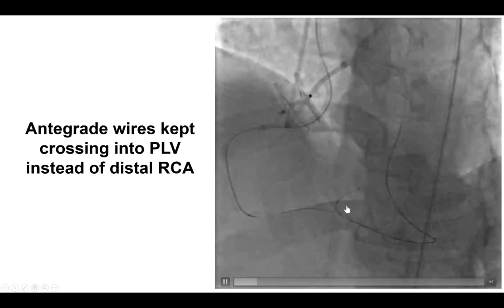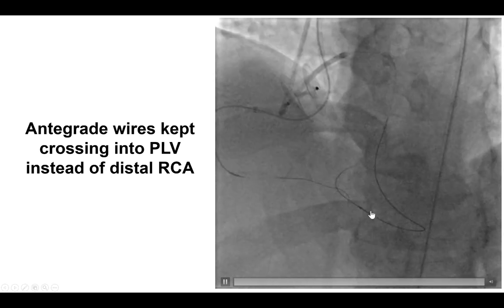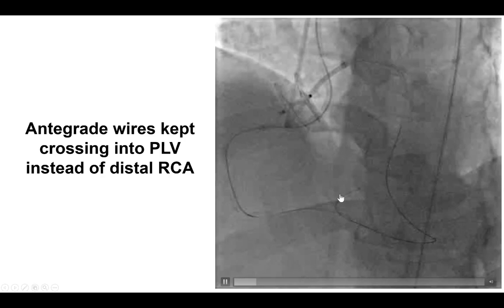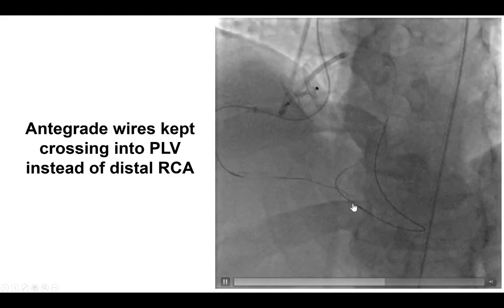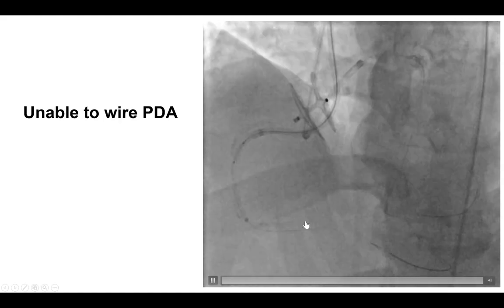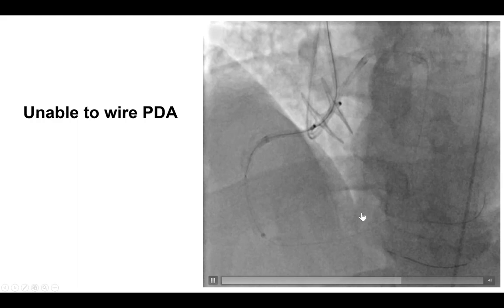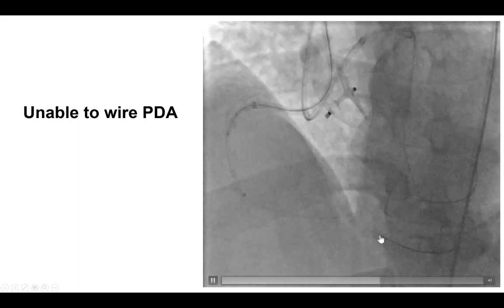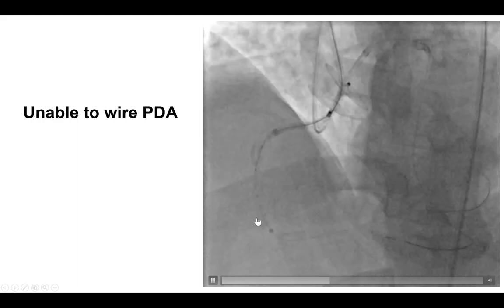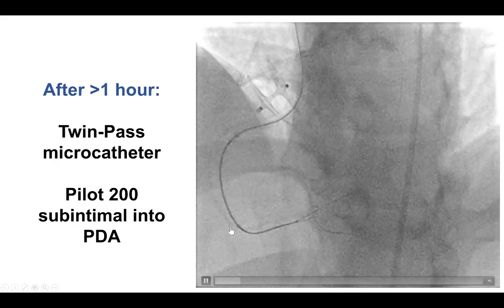Now that we had a sort of a marker wire into the PDA, we tried to do repeat antegrade wire escalation and it did appear at some point for the wire to go into the posterior descending artery. However, the wire eventually went into the right posterolateral branch and we had a very difficult time advancing the wire into the PDA, despite using a guide catheter extension for better support.